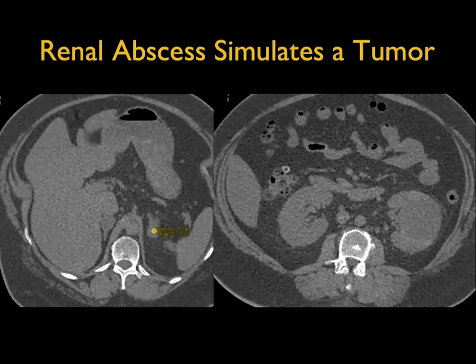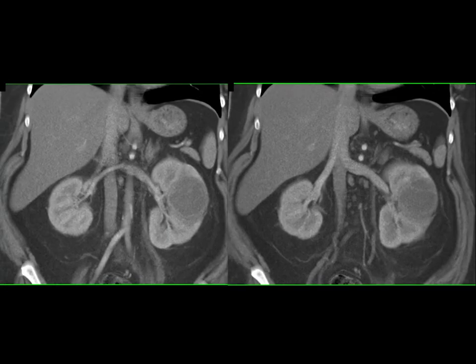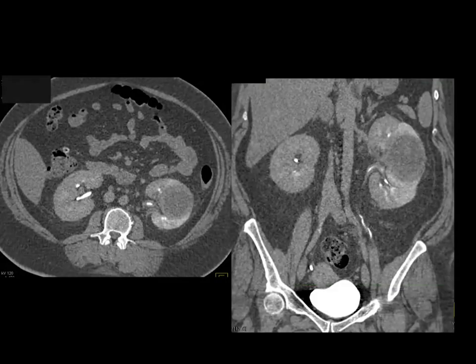Or this example, again, adenoma, left adrenal. Here's the kidneys. Look at the left kidney. Look at that zone of patchy decreased attenuation. Looks like a mass or a mass effect. There's no discrete mass there, but what you're dealing with on the excretory phase imaging is infection, and you're dealing with pyelonephritis. So just a very good example of pyelonephritis, which then progressed into an abscess.